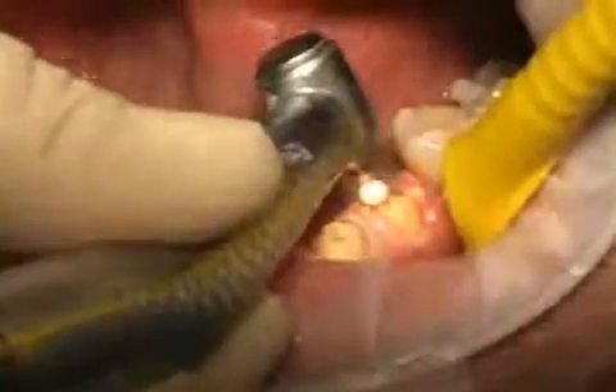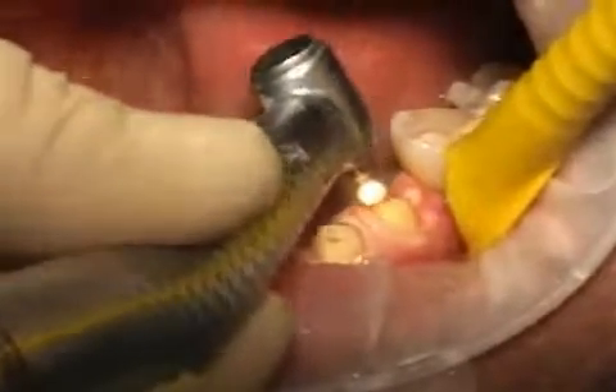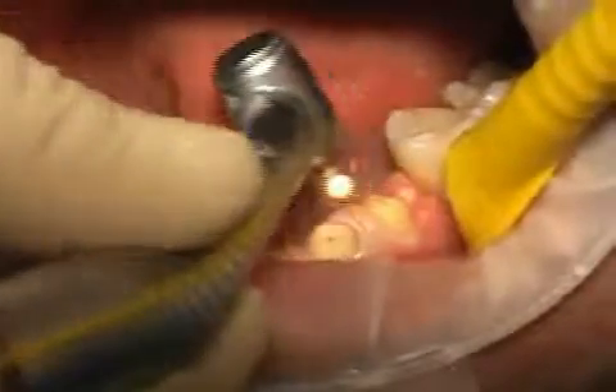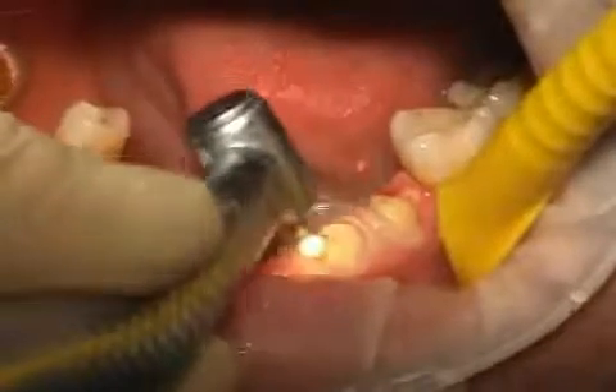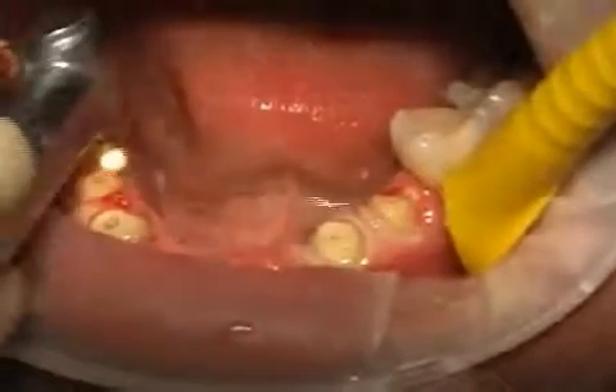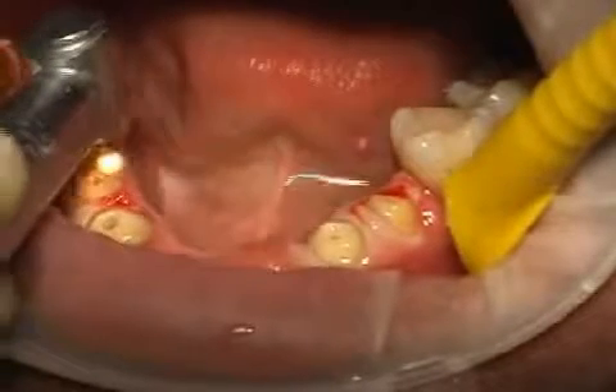In the film, you can see the grinding of a tooth root with a retentive anchor. When grinding is complete, the edges are polished with an Arkansas stone — in this case, a sphere. The polishing, or edge breaking, results in tighter fitting dentures and a reduced risk for cavities.